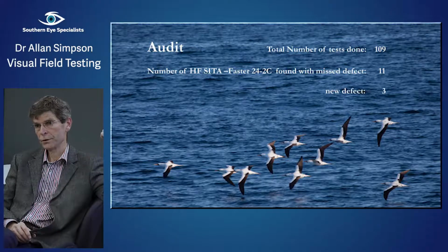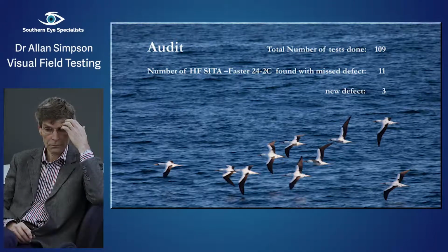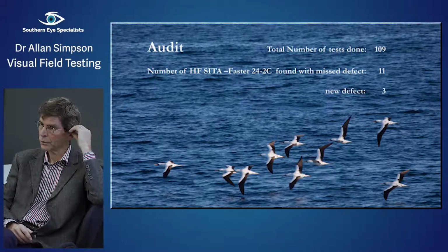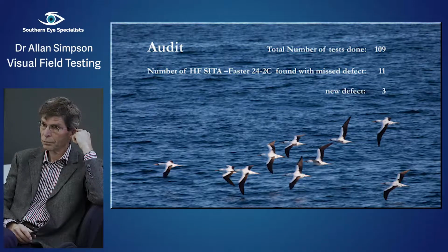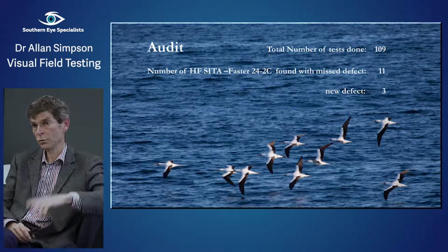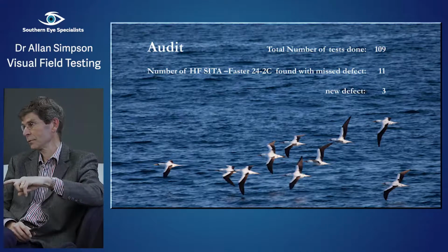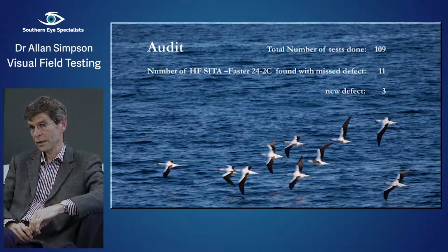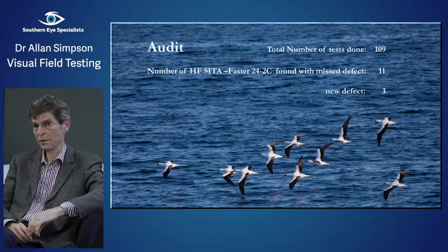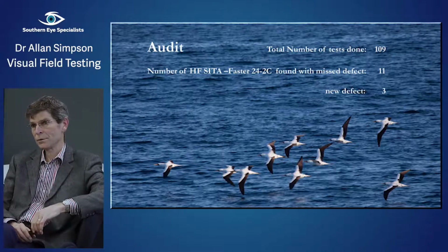We were doing it with old full threshold algorithms. It took 12 minutes or something horrendous on those first machines. And I remember a couple of scientific officers in the eye department at the Oxford University clinic that I was working in for a year, scoffing at the idea of computerized perimetry, and saying that all the stuff we're collecting now and all the interpretation we make of those tests is statistical, and all of that means you need to have many tests to make those statistics valid, because just one test on one particular day in itself is not valid. You can't say this has got a 95% probability of being outside normal range unless you've got a whole lot of tests to validate it. And so they were saying, maybe you could use that if you do lots of tests every 3 months or 6 months or whatever. So that was the first thing that's always been in the back of my mind.